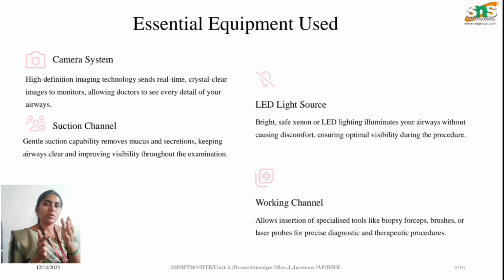And here I have mentioned the same thing we discussed in the last slide. These are the few essential components that I pinpointed in the previous slide: the camera system, suction channel, LED light source, and finally the working channel. What I'm talking about with the working channel is that it is specialized for many tools like biopsy forceps, brushes, or laser probes.